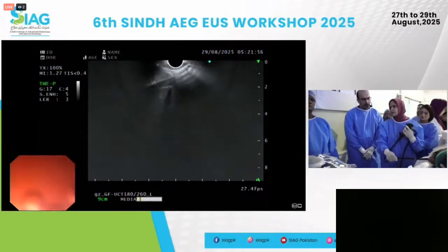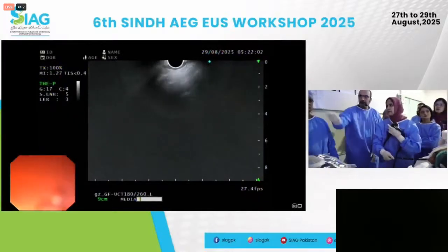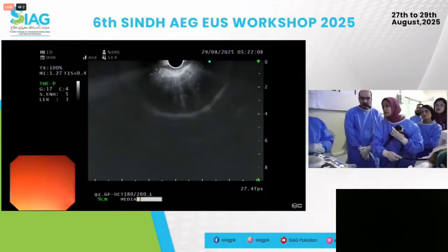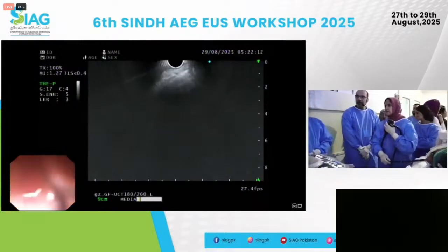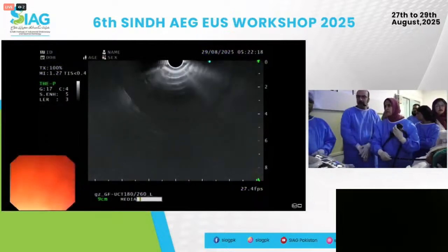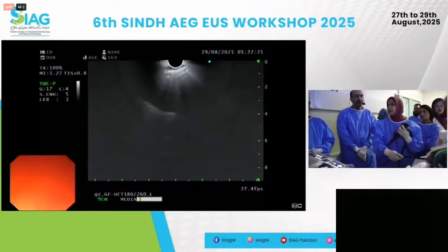Along with it, recent MRCP was done, which was showing suspected pancreas divisum. There was a stricture in the pancreatic head, followed by ERCP, which confirmed the diagnosis of pancreas divisum plus stricture. A stent was placed in June. Currently he is here for endoscopic ultrasound evaluation of chronic pancreatitis. And the stent is through the minor papilla? Yes, sir. Okay. Yeah, so let's just reset, go back into the.